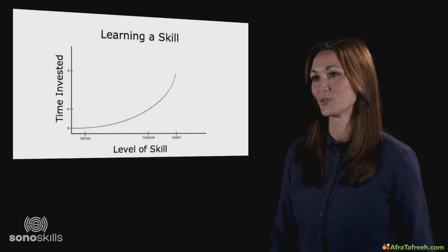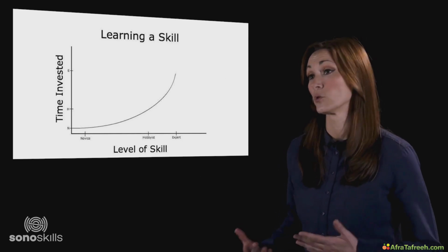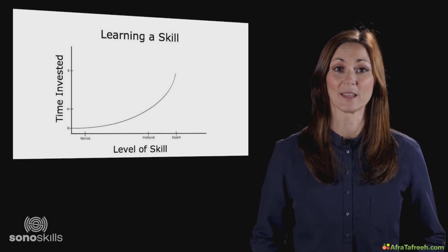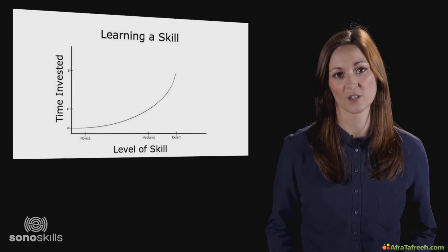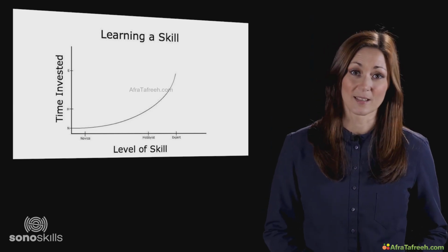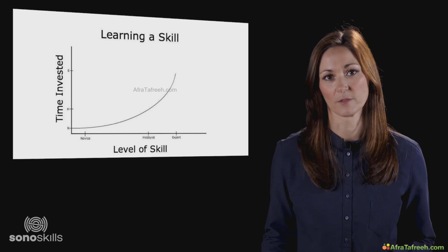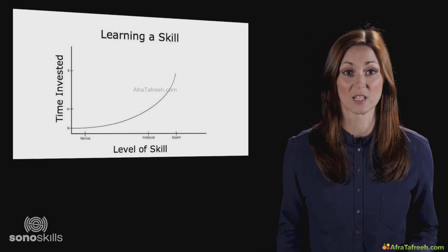The first important key message of this presentation is that you should not make any hard statements, not to patients and not to colleagues, until you have sufficient experience. Research has shown that you have to make at least 100 to 200 scans per anatomical tissue before the diagnostic accuracy is satisfying. 200 scans sounds like a lot, but if you scan this particular tissue 20 times per week, then within 10 weeks you've met the criteria. If you only scan 4 times a week, it will take you 50 weeks, almost a year.